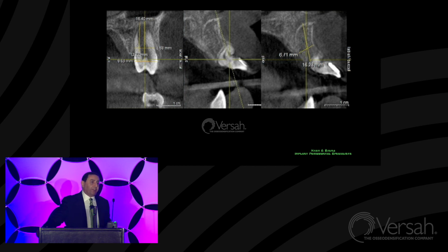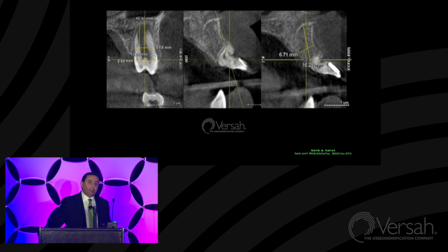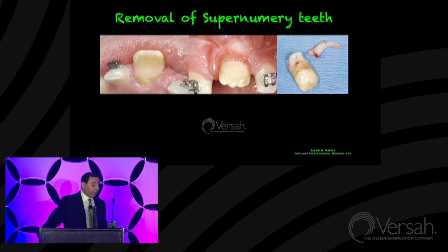But in this particular case, why not densify the bone? And this way we're not cutting away the bone. So as careful extraction as possible has to be implemented in those particular cases. So we remove the supernumerary teeth, the coronal part, and the odontome that had a hook on it, which, as small as it is, was surprisingly somewhat difficult to remove if you don't want to damage the bone. Of course, it's easy to remove if you're okay cutting away bone, and this defeats the purpose. We're not trying to cut away anything here.